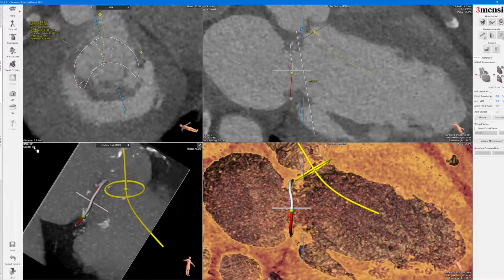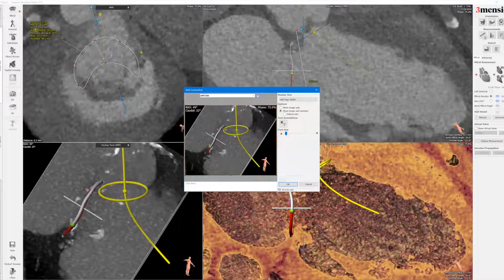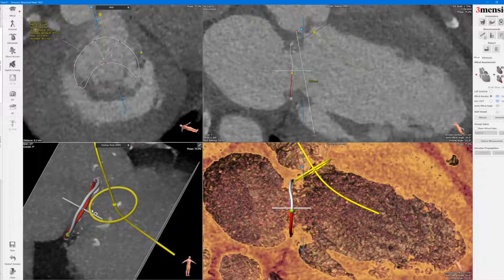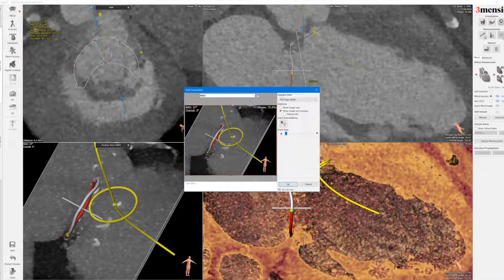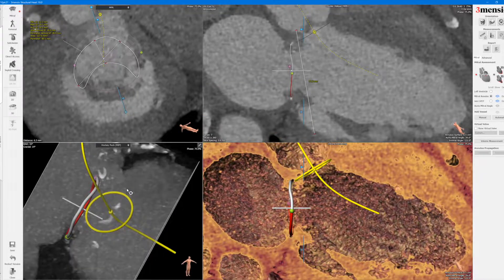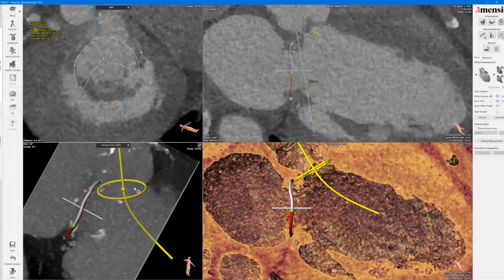You can see this is a pretty steep angle when you just rotate the two poles together. You can keep rotating until you have a better sense — this is certainly an easier angle to work with. You can even go more extreme, but you can get too cranial. So that's how you determine the fluoroscopic angle.